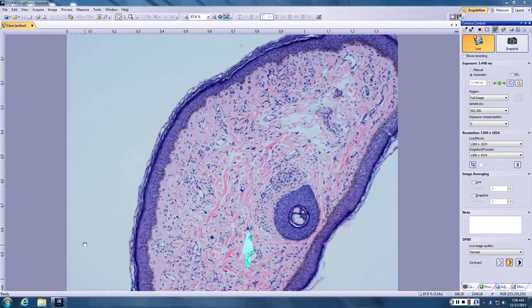Yeah, stellate, so they could be fibroblasts. So what's that leading you towards? There's not a whole lot of secondary adnexal structures in there. Depending on the body site, I thought about things like acquired digital fibrokeratoma. Does it look like acral skin though? No, not quite.